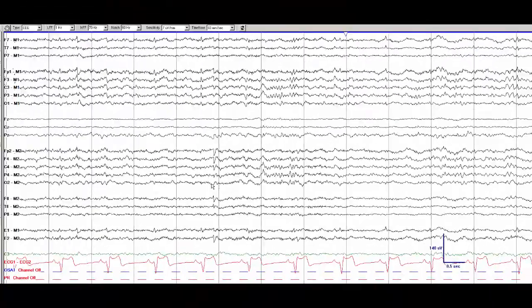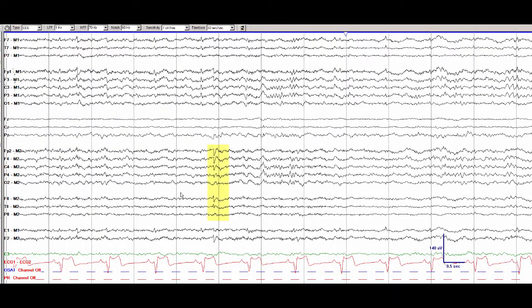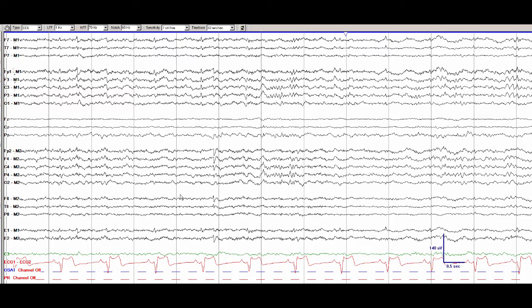Here is an example of a small sharp spike in the contralateral hemisphere, but it is not necessarily unusual for there to be a predominance on one side or the other, particularly in a short recording.